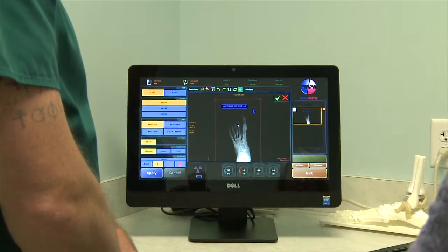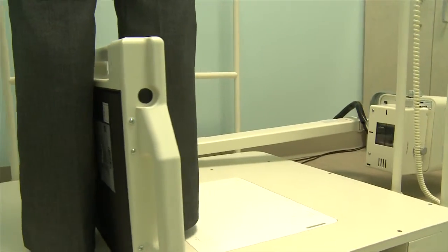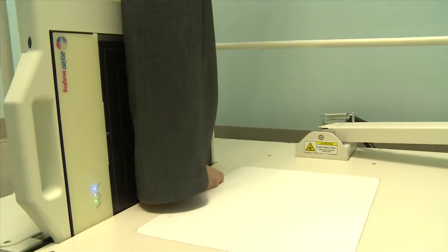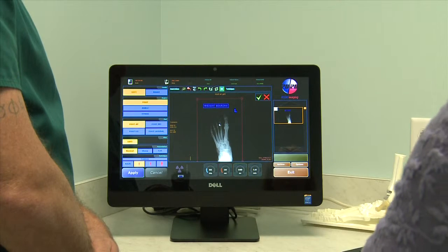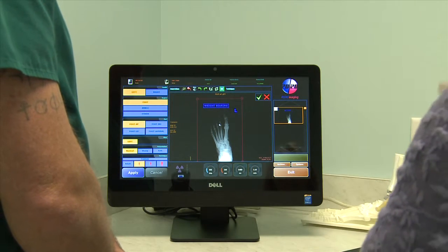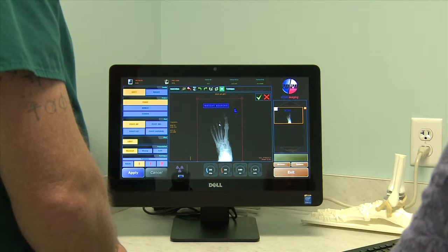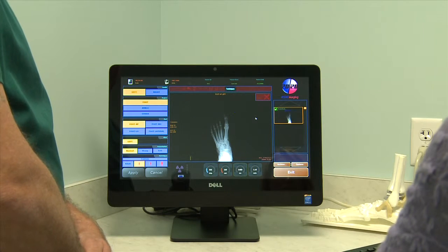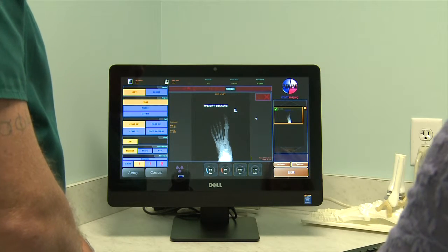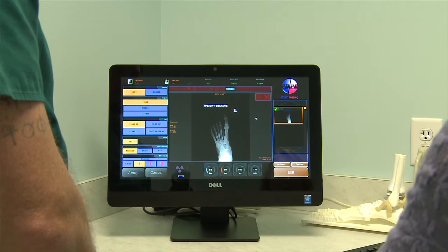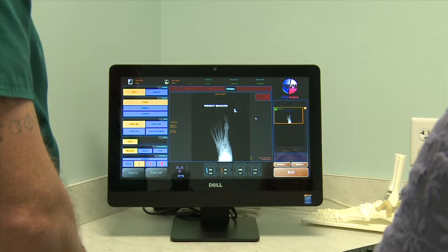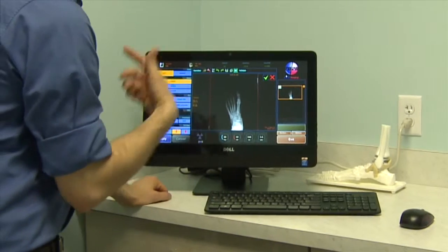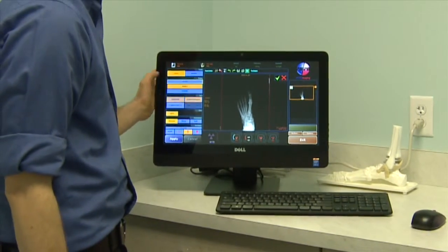Once you're satisfied, you can just continue taking x-rays. If a patient's foot is hurting, take your AP, it comes right up on screen, and tap the next view. You can accept and reject at the end once the patient is seated. Any technician would come over and hit the next view — say a foot oblique or medial oblique.